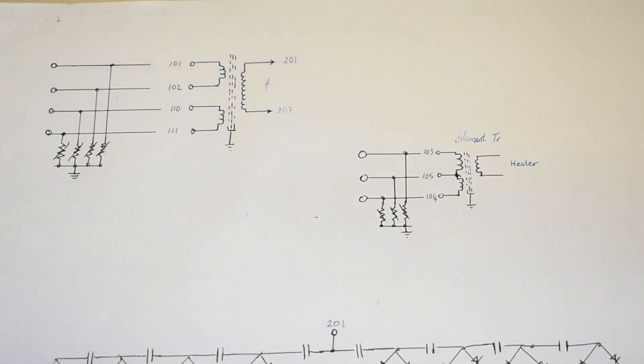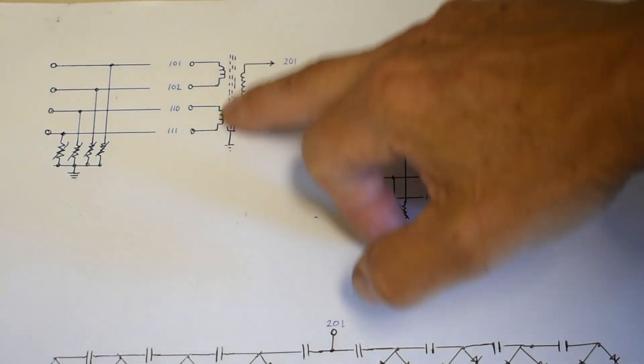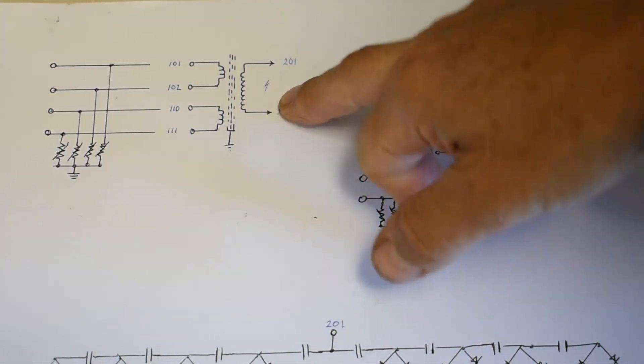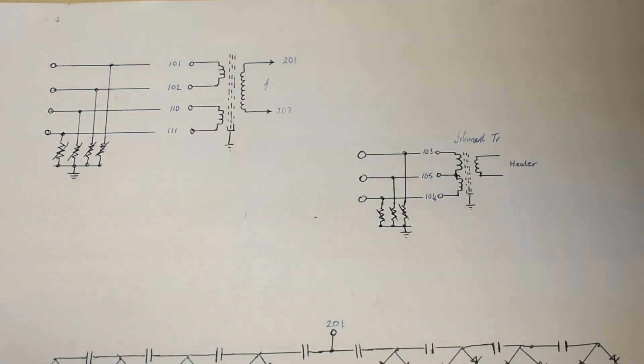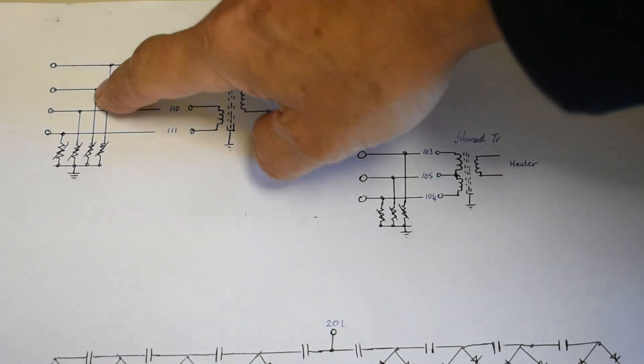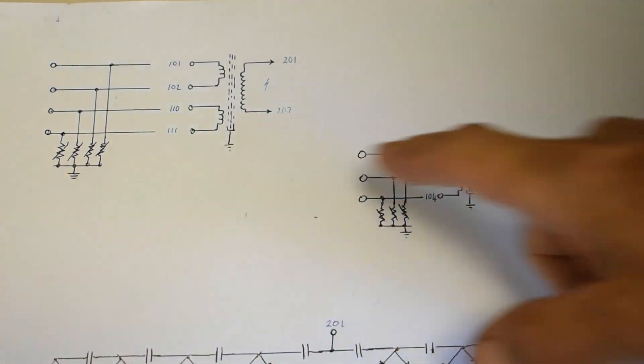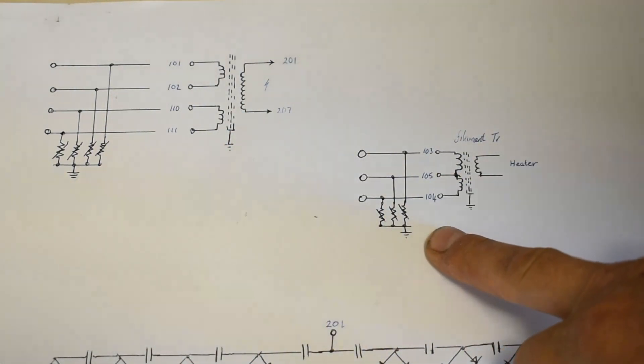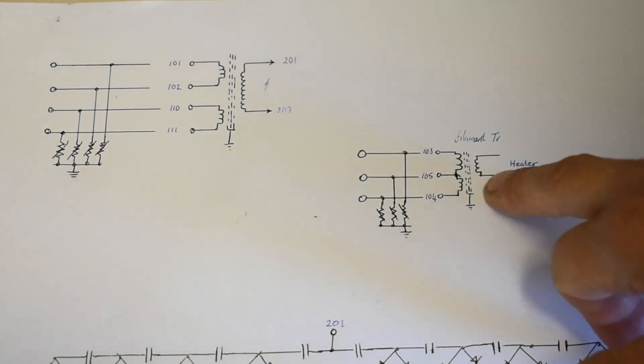Here we can just quickly go through the diagram for the X-ray head. I've got the transformer here, this is the high voltage transformer. There's two primary windings in there and the inputs are on the board and they're all protected by varistors and likewise in the primary transformer for the filament.